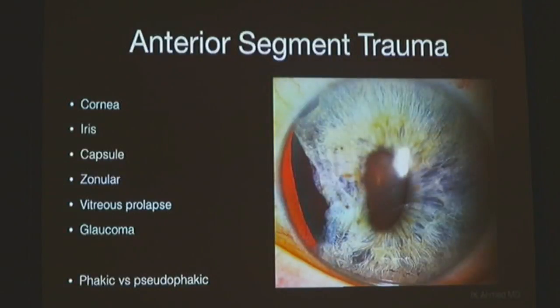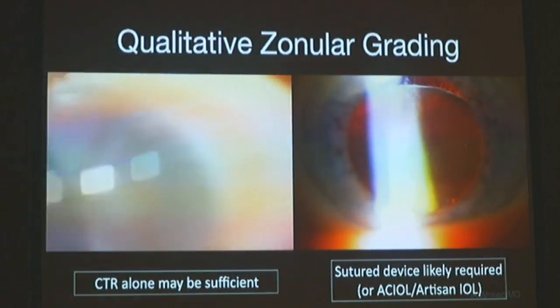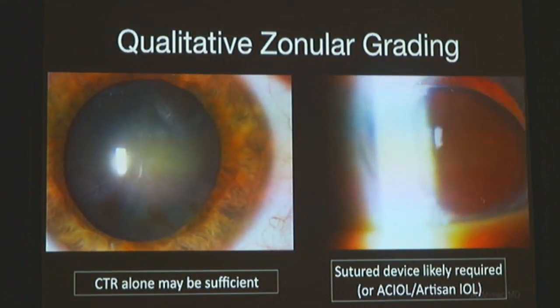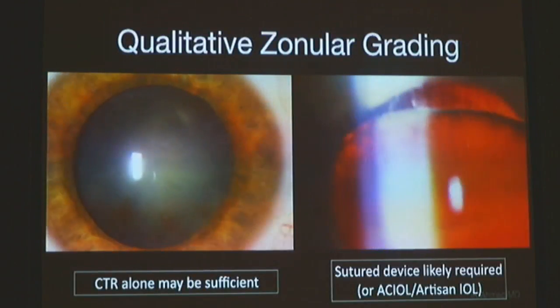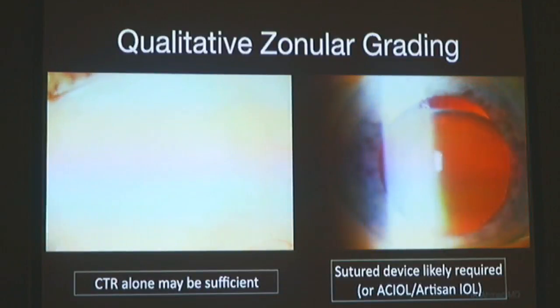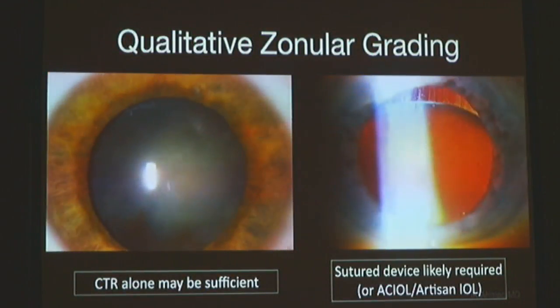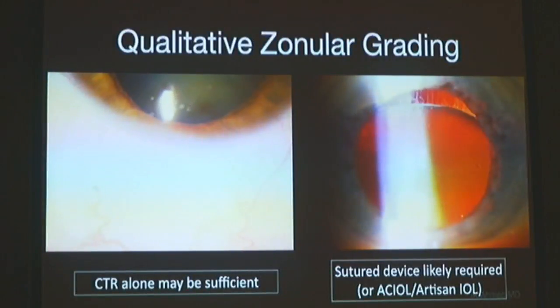Okay, so this talk I made, trying to put it together because we had some changes from the morning, talking a bit about trauma. So we'll talk a bit about trauma here. Talk about dealing with some of these zonular problems. Now, how many here do some traumatic repair of the anterior segment? Cataract, iris, okay. How many here do eye surgery? Just keep it broad for now.